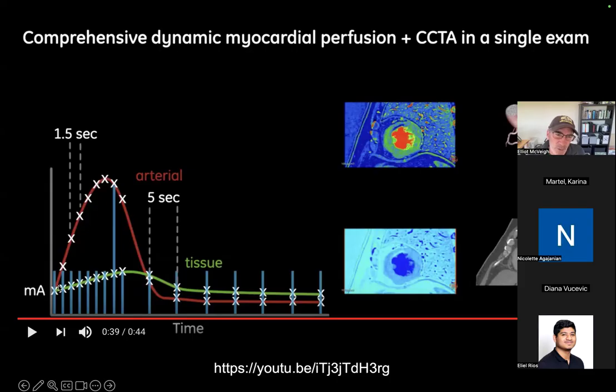At those same time points, it does increase, but it increases at a much slower rate. And it increases to a much smaller maximum amplitude. The rate at which it's coming up, if you normalize it to the amplitude itself, can be pretty well similar to this. It's being driven by that injection.